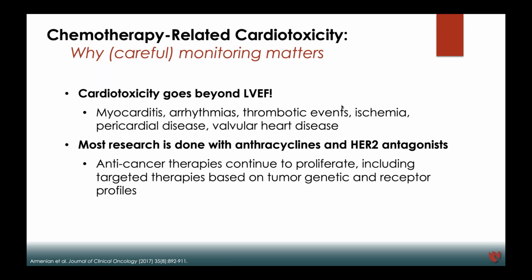cardiotoxicity goes beyond just LVEF. We can have complications like myocarditis from checkpoint inhibitors, as well as arrhythmias, thrombotic events, ischemia, pericardial disease, valvular heart disease. So a lot of things that can happen that we need to be aware of, and cardiac MRI is a great tool that we can use to diagnose these potential complications.